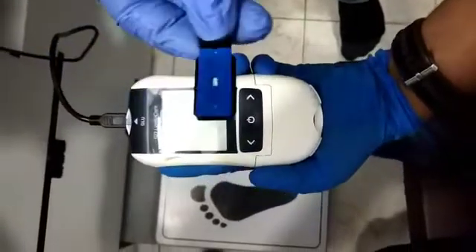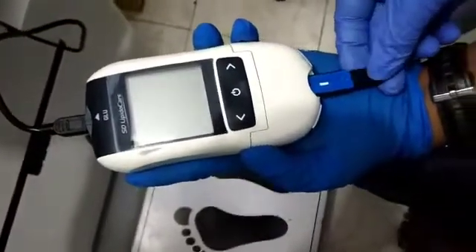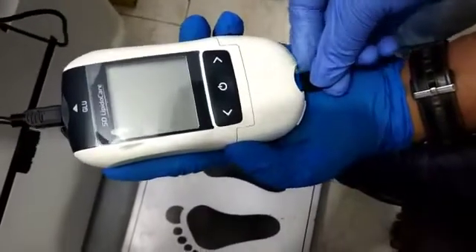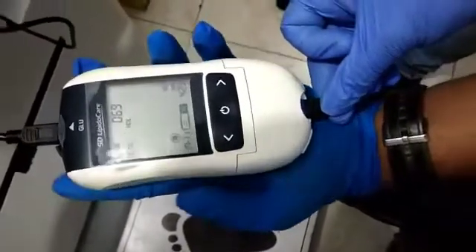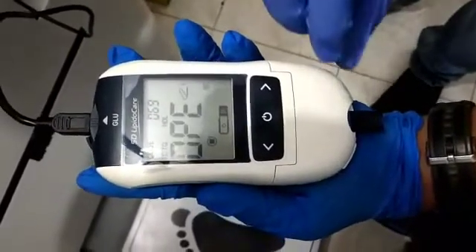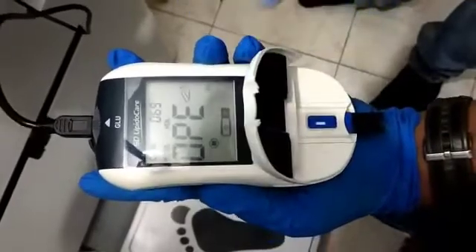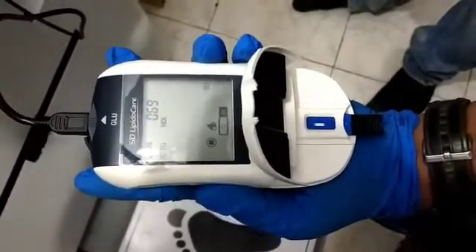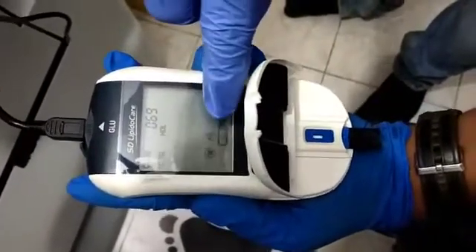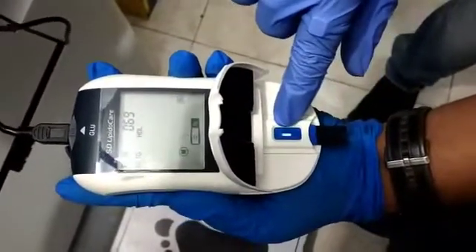This is the lipid strip, which we have to install on the below side of the machine. See the suggestion on the screen. Now they are asking us to open the panel, and it is showing to put the blood sample at this point.